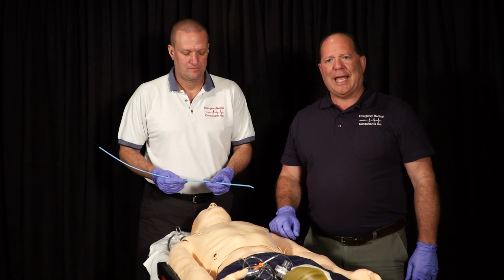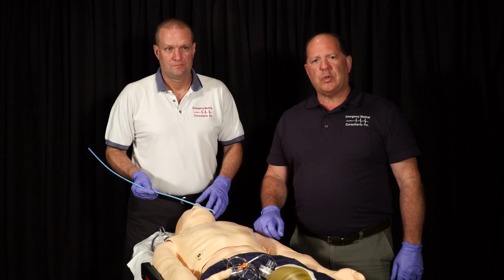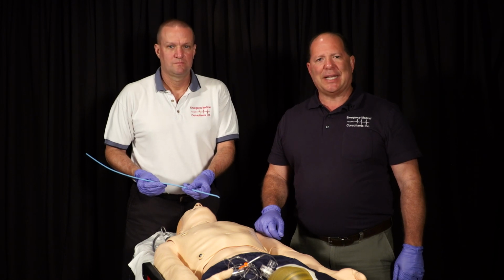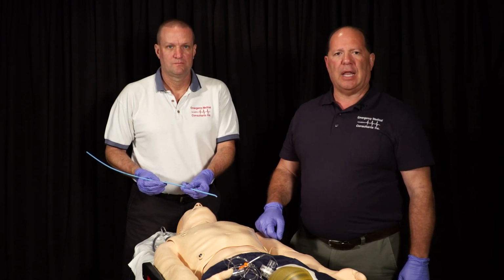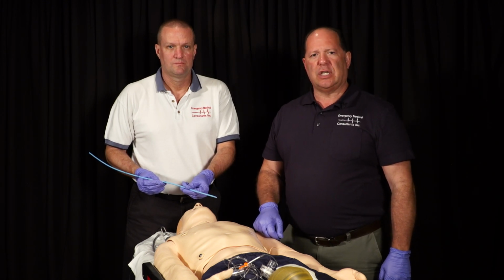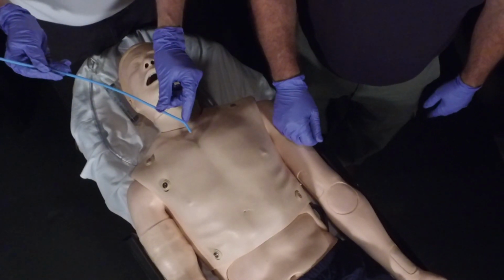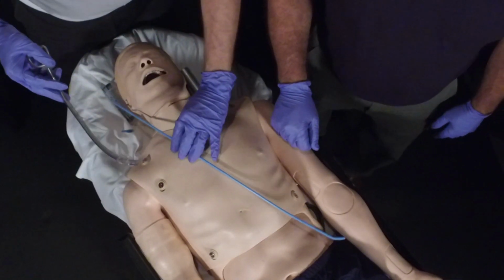The bougie stylet is a great device for feeling your way into the trachea when visualization is difficult or impossible, whether it be from anatomy, from position, from excessive fluids in the airway, or any other area where you can't manipulate the posterior pharynx or the jaw to adequately see the glottic opening. Ideally, we take this device with a curved end. It's like a soft plastic stylet, and we're going to place our tracheal tube over that.